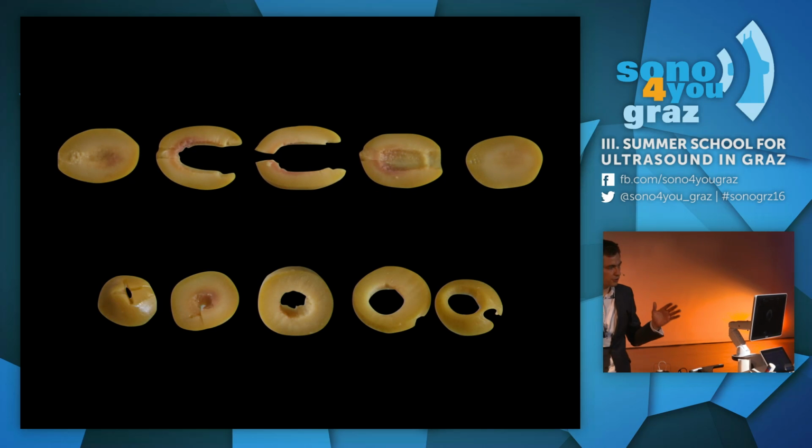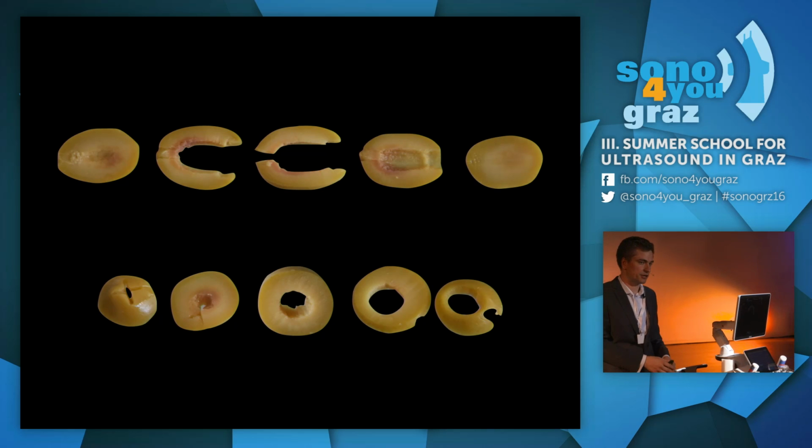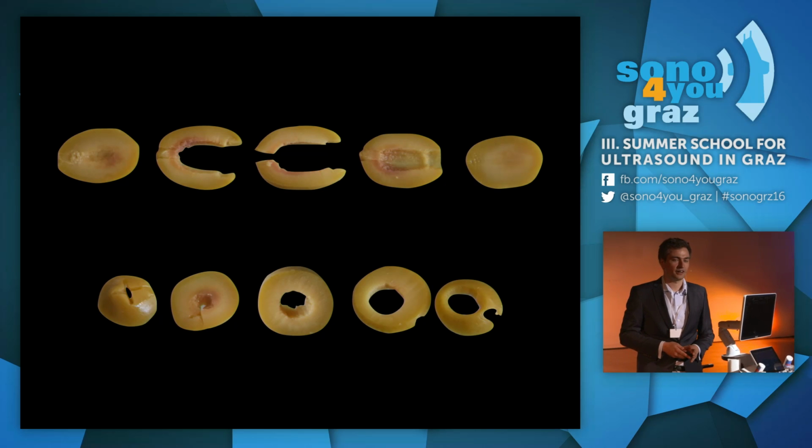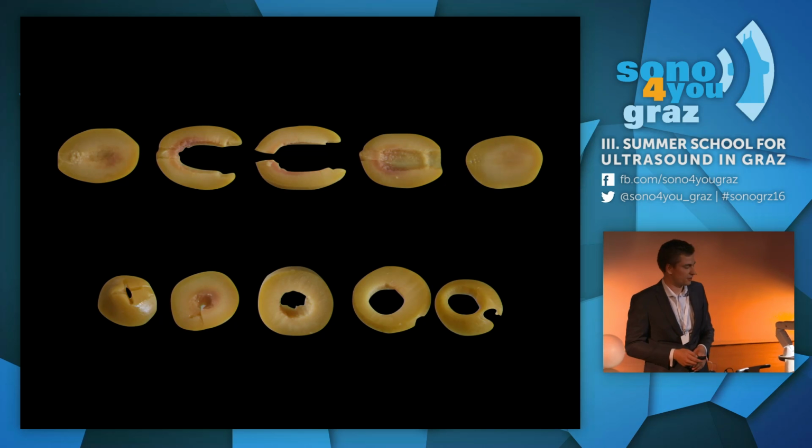And what we did, we sliced it up all the way through. Okay, you might tell it's an olive. And if you took in two planes, scanning through the whole volume, you might have this image. And also, you might understand the structure, and you can tell this is definitely an olive.